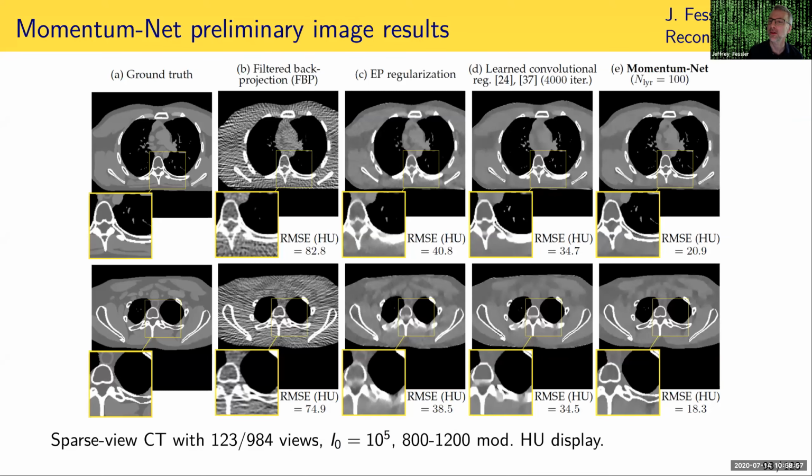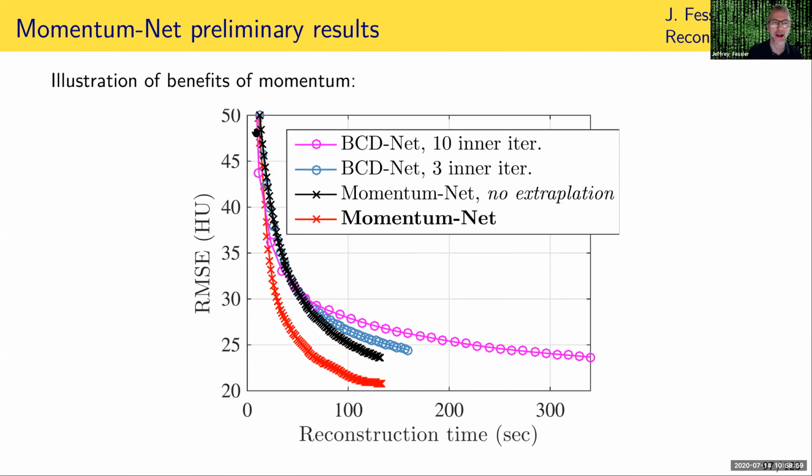I'd have to check with Il Yang, but I can't count how many points here to see whether, oh no, I'm sorry, it's probably those 100 points right there, because it would be this algorithm right there. So it doesn't look like we could have stopped a lot earlier. It's plateaued here, maybe 80 or so iterations. Yep.